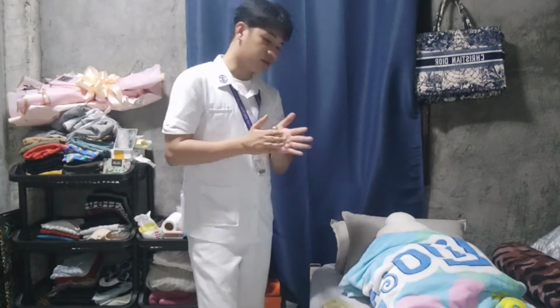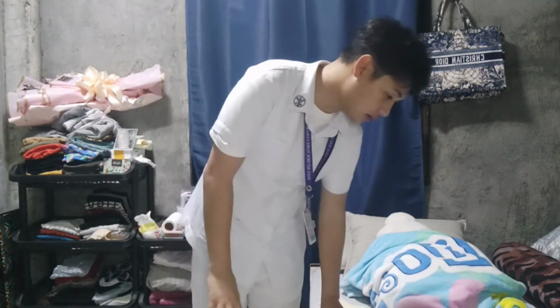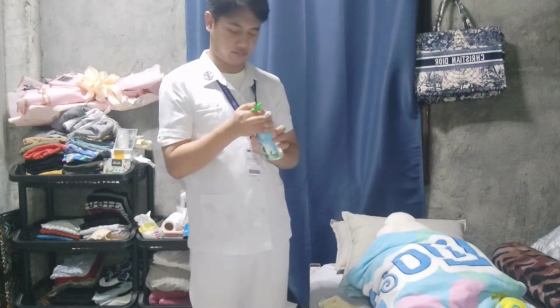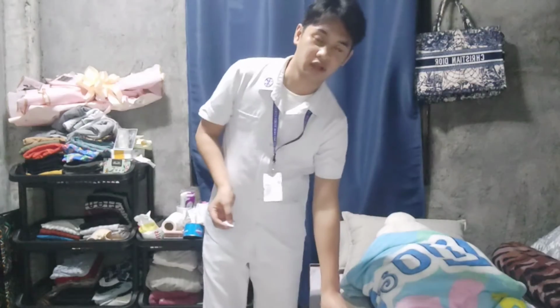So we're going to use antiseptic wipes. In my situation, I'm going to use cotton with alcohol. I'm going to clean the vial.